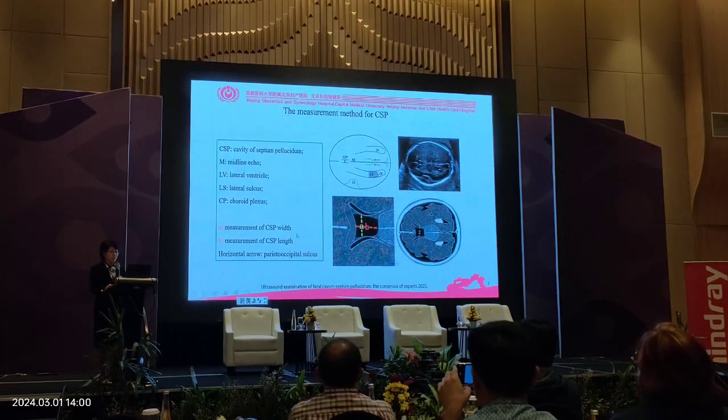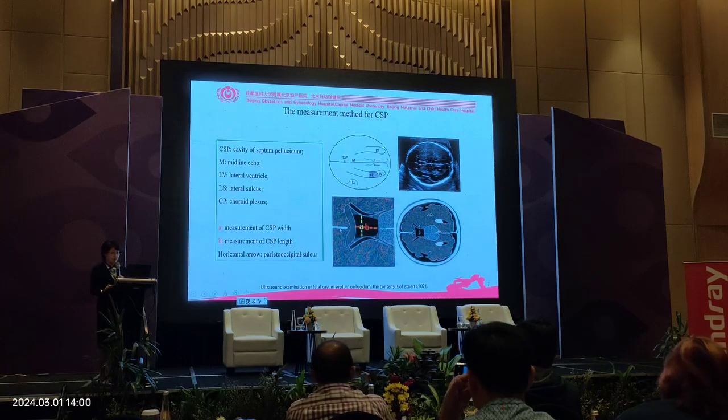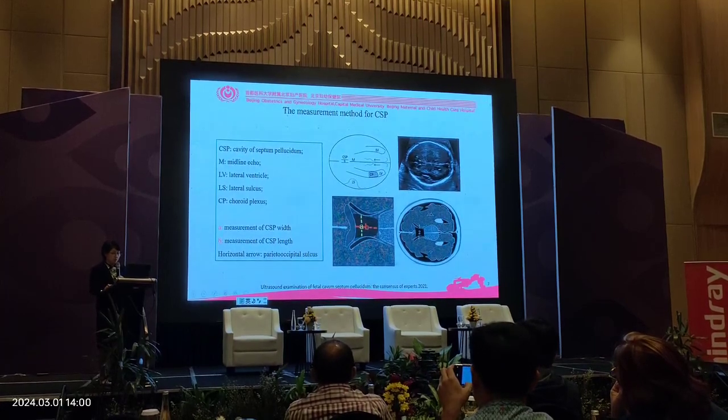In this picture, I will show you how to measure the CSP, the cavum septi pellucidi. It's bigger or smaller, and we should observe the shape.